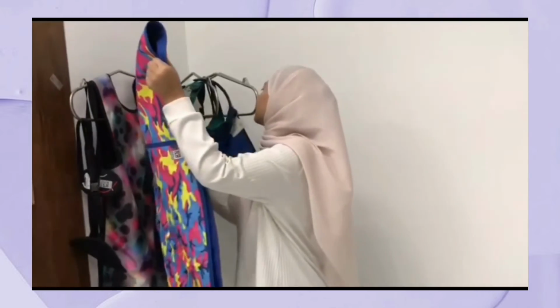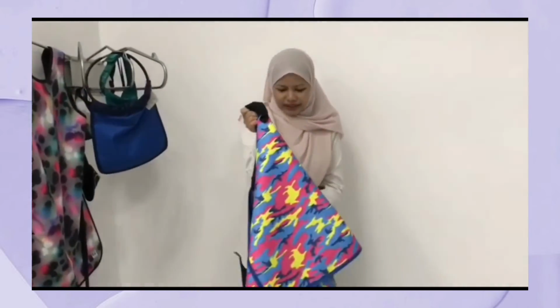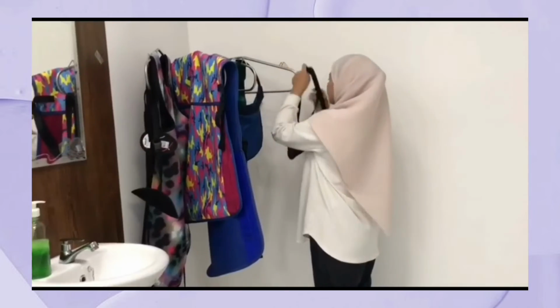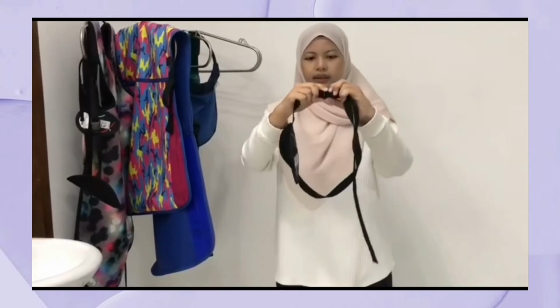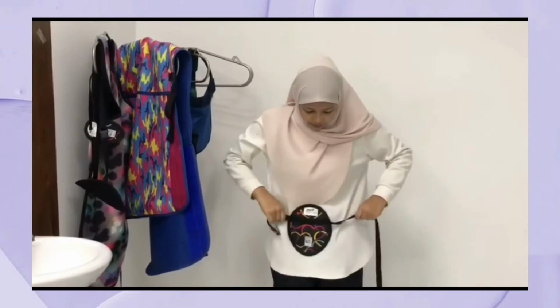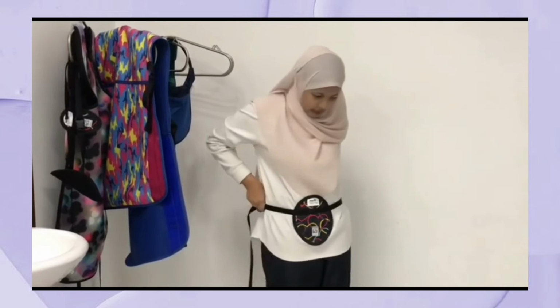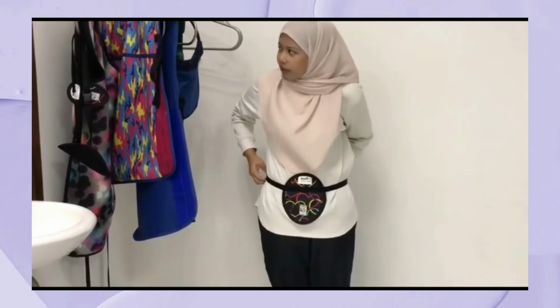As an example, this one. This is the gonad shield. Okay. Open it, and place it like this. This area. Okay. Click. Okay. Like that. Okay.